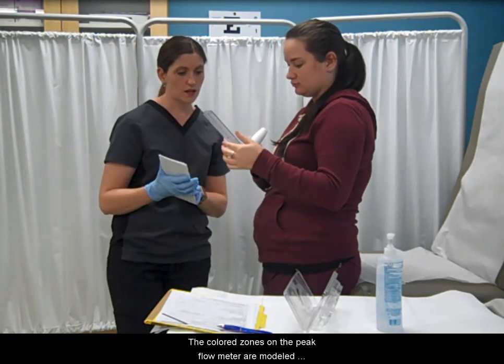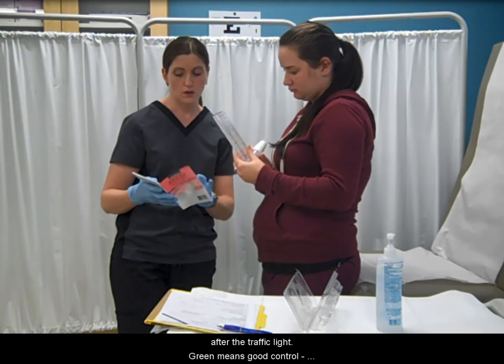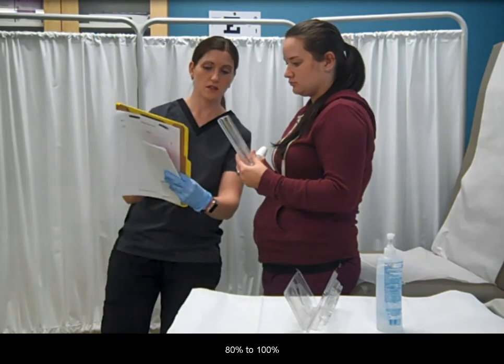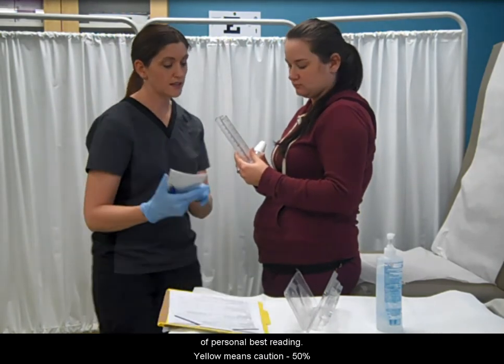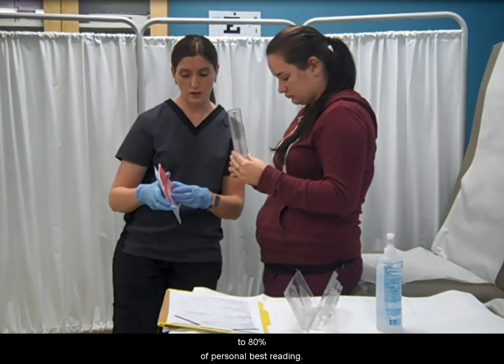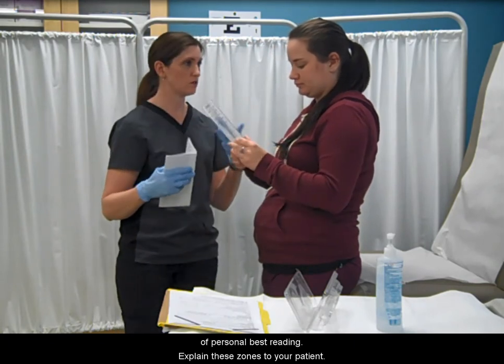The colored zones on the peak flow meter are modeled after the traffic light. Green means good control, 80 to 100 percent of personal best reading. Yellow means caution, 50 percent to 80 percent of personal best reading. And red means danger, less than 50 percent of personal best reading.